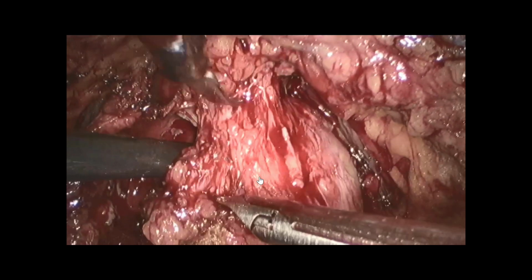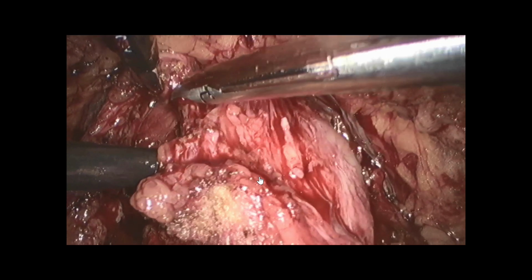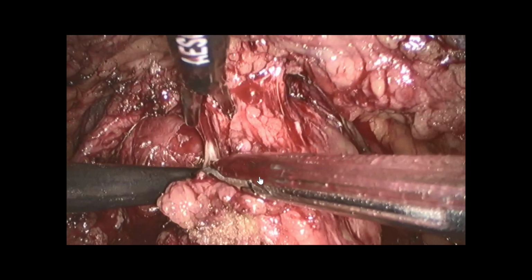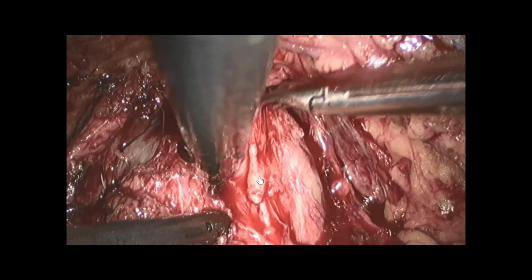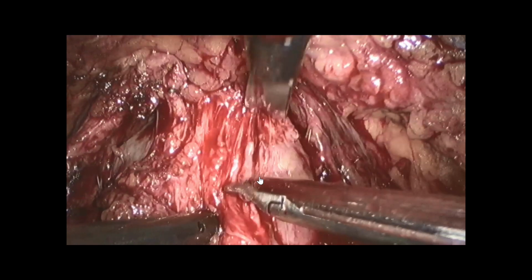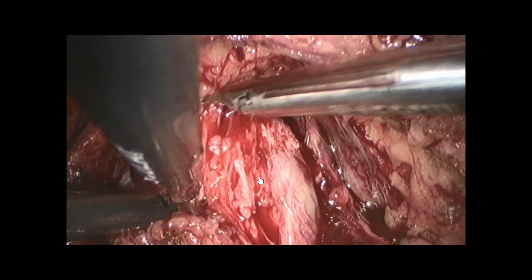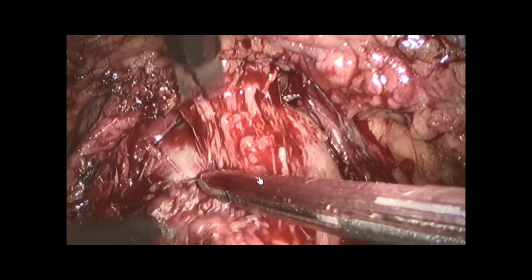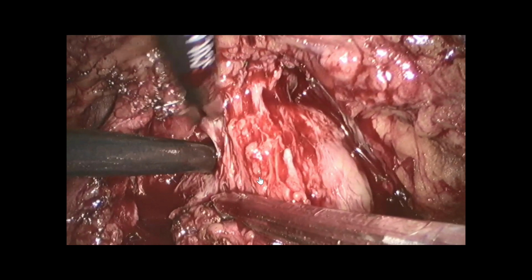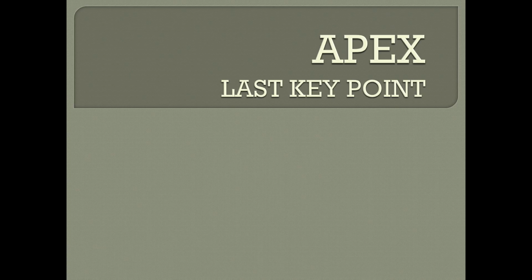And now you have to deal with this. If you want, you can place a thread previously. Personally, I don't place the thread now. I was doing it in the beginning of my experience. I think there is no benefit. I don't place more pressure in the cavity. I just ask the assistant to stop doing big suction, because if you do big suction, then you will have more bleeding.